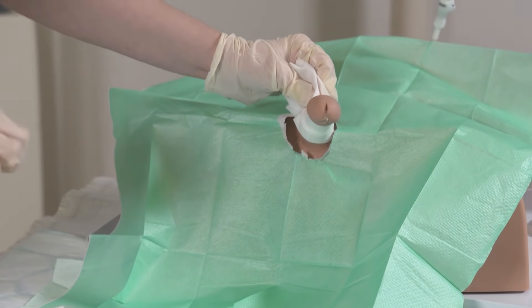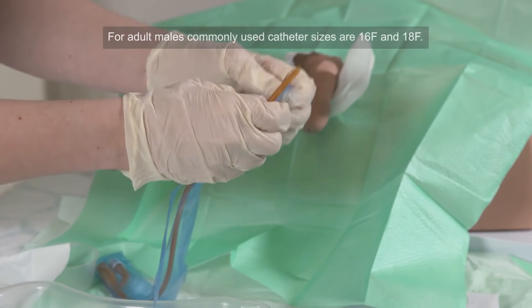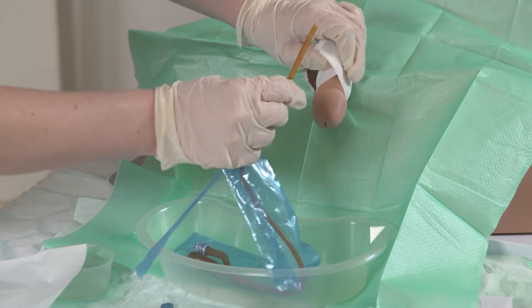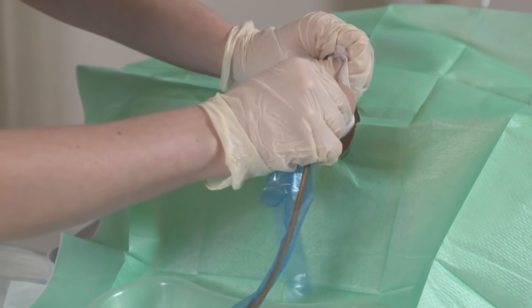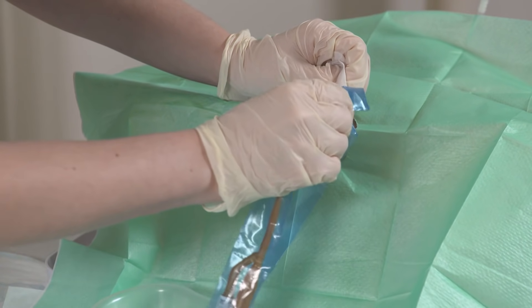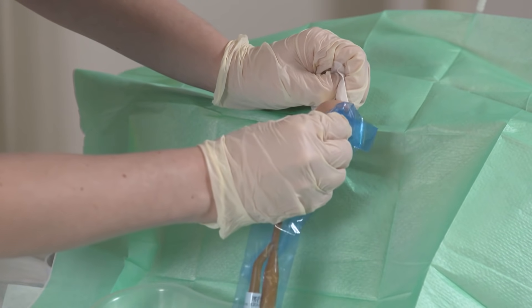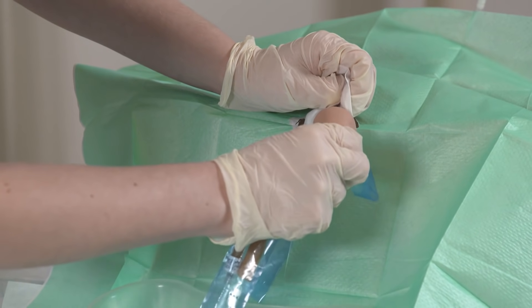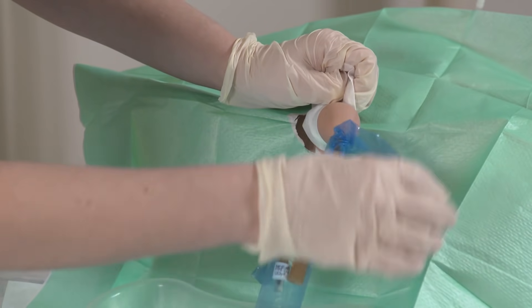Holding the penis in an extended position for a few minutes to allow that instiller gel to work, we'll then open our catheter. Place it in the kidney dish nearer to the patient and dip it in our instiller gel. Then we're going to insert it into the penis — it should pass relatively smoothly. You want to extend it right up until the bifurcation if possible.